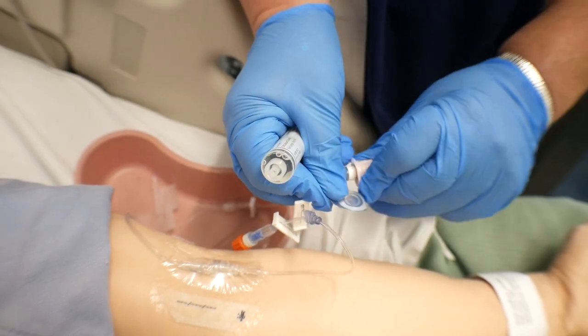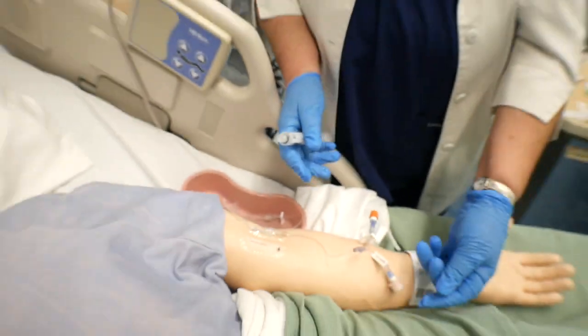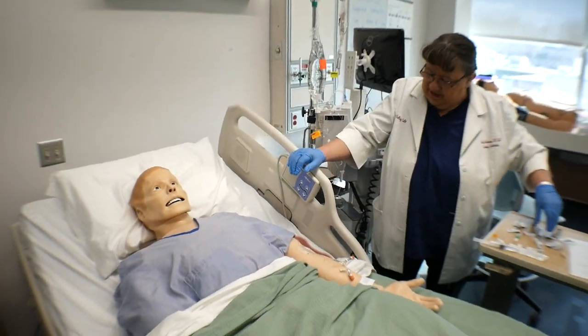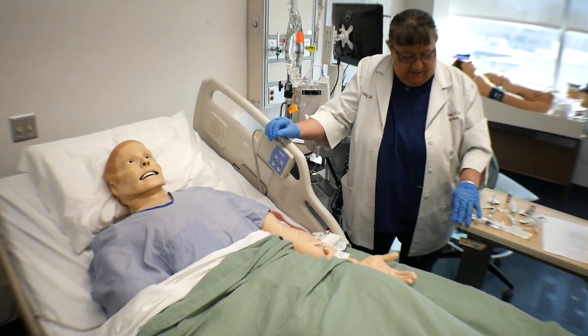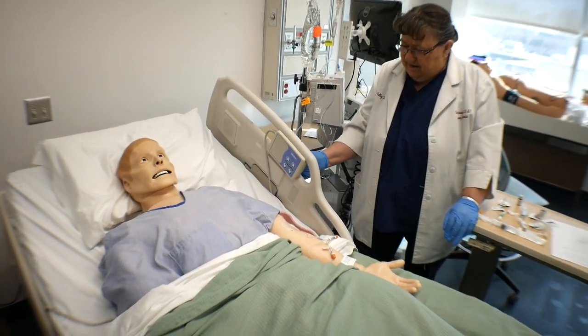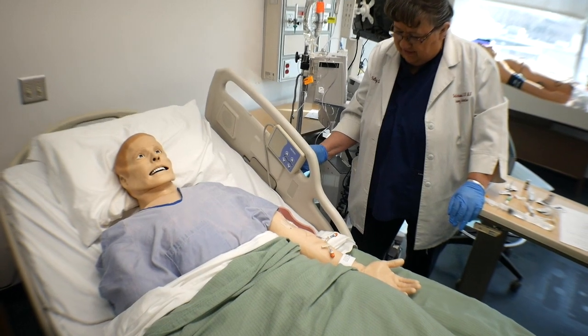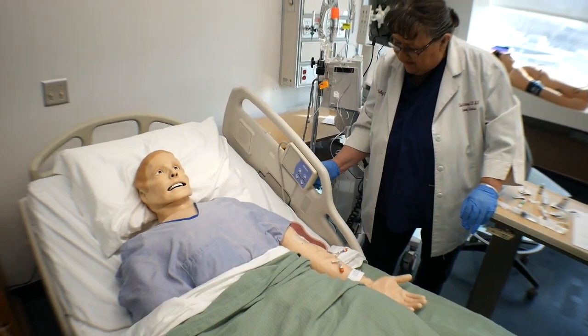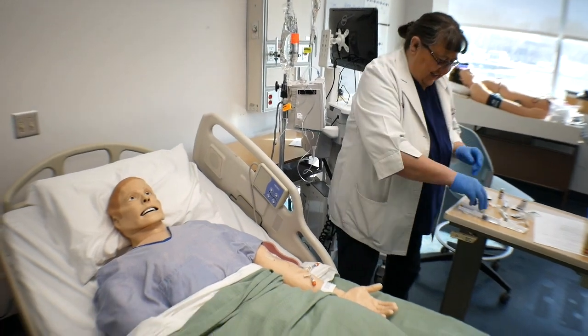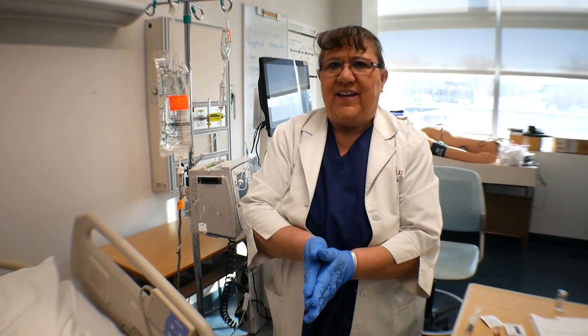And we're all done. Okay, Mr. Smith, I'm all finished with your medicine. So let me know if you have any problems like dizziness or anything like that. You've gotten it before, so I think you'll be okay, but anything that's different, let me know. Okay, and that's it. Now I just need to clean up all of my supplies.